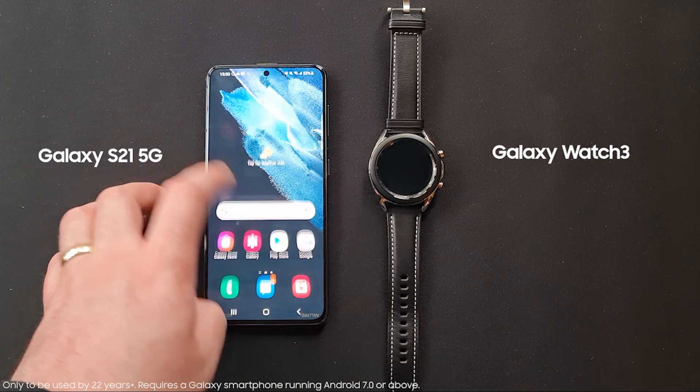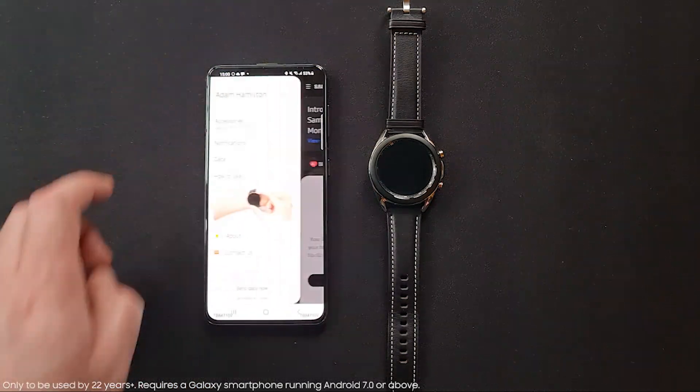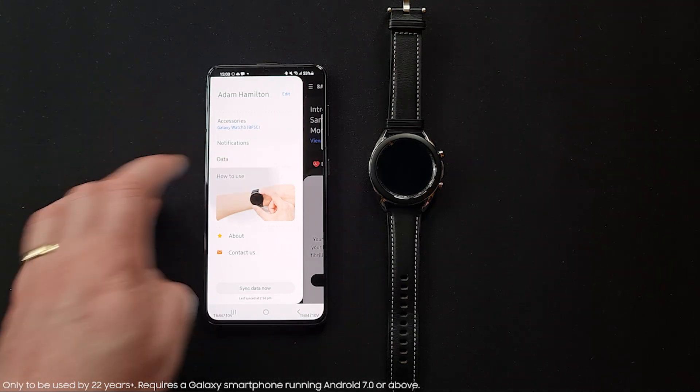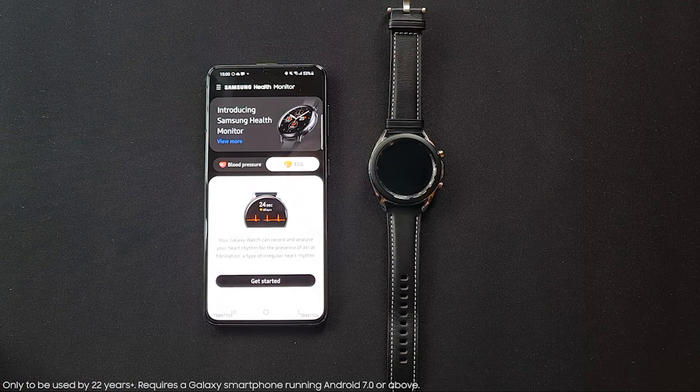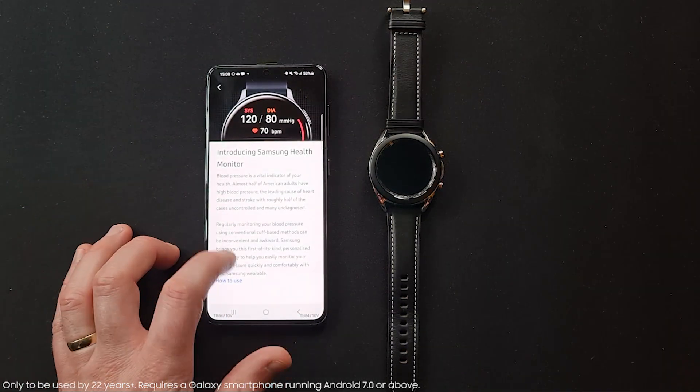You can now quickly and easily check your heart rate and rhythm using an electrical cardiogram function on our Samsung Galaxy Watch 3 and Watch Active 2. It is now available in the UK via the Samsung Health Monitor app, meaning you can monitor your health wherever you go and whenever you wish.